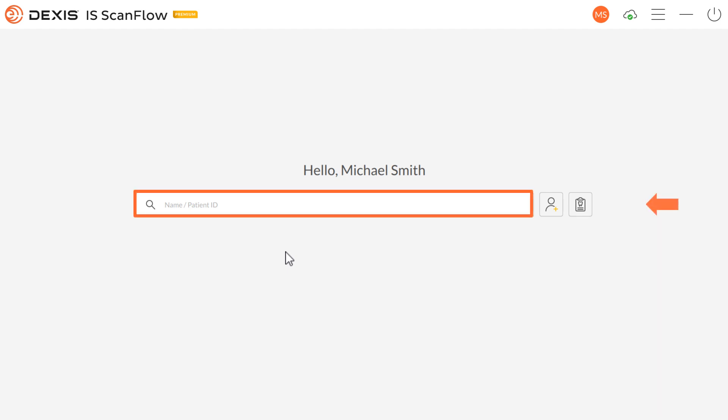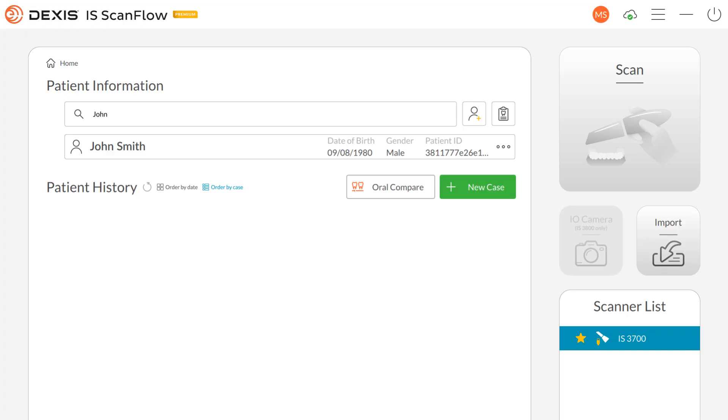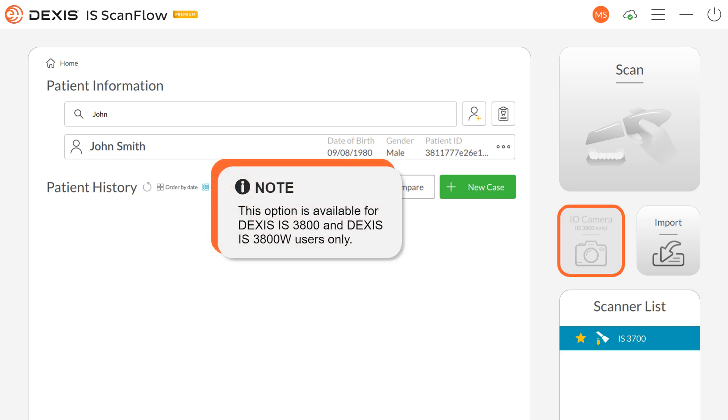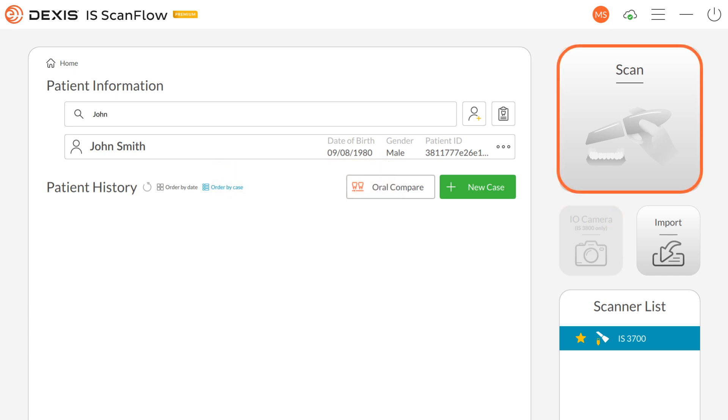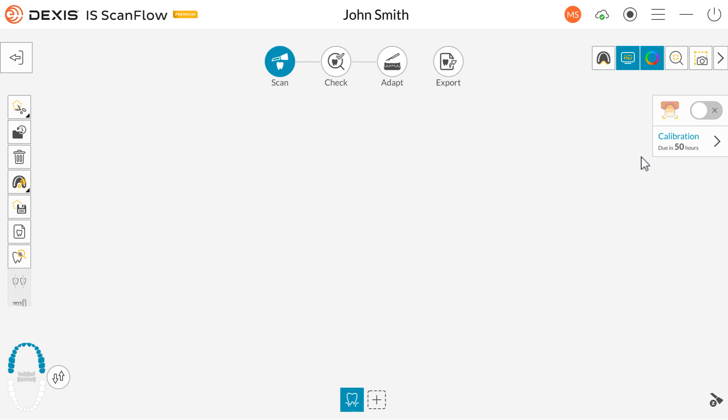Search for or create a patient and choose your patient. The Patient Information window is displayed. In the Patient Information window, you can choose to scan, import a scan, or choose the intraoral camera to launch it. Note: this option is available for DEXUS IS3800 and DEXUS IS3800W users only. Click Scan. The DEXUS IS ScanFlow window is displayed.